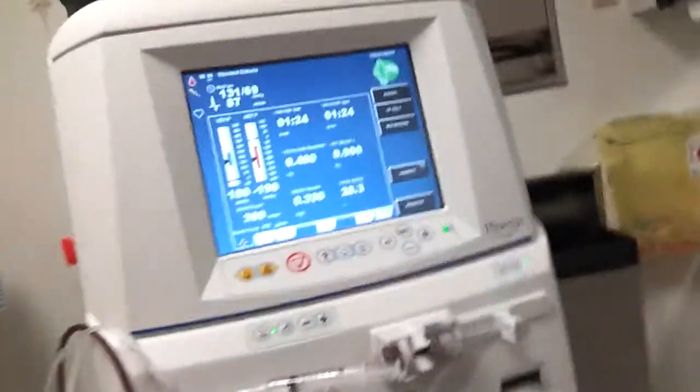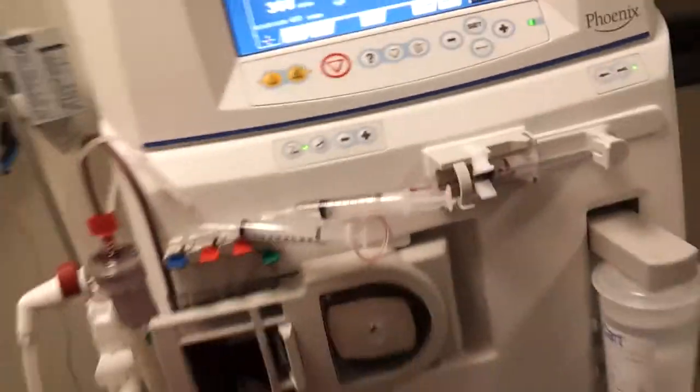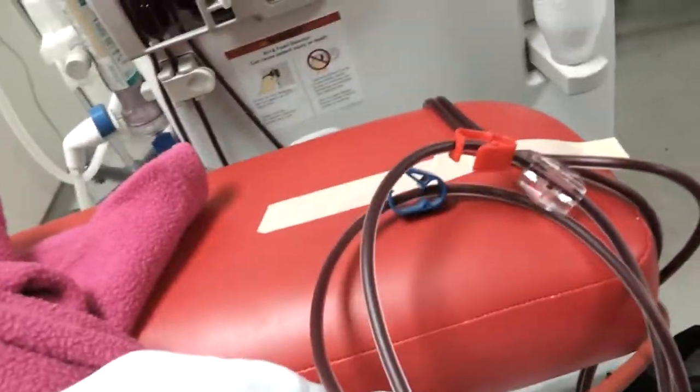This is our dialysis machine that we have here at our dialysis unit. And currently right now I'm connected to the machine. These tubes are actually connected in my chest. And there's two tubes. One is the arterial side, one is the venous side.